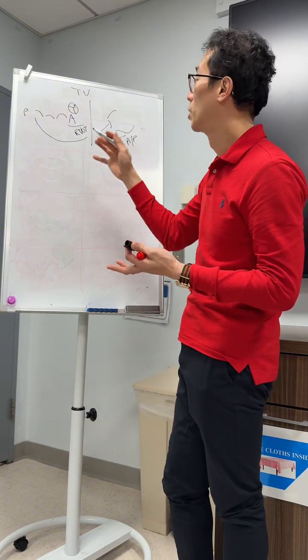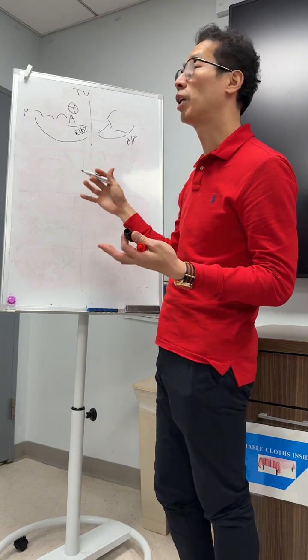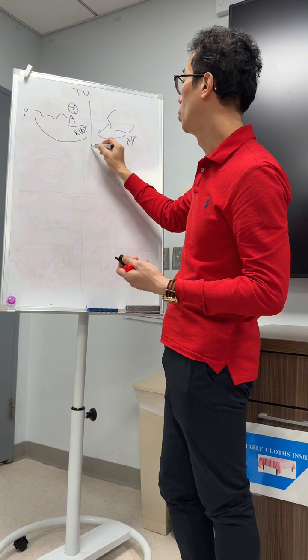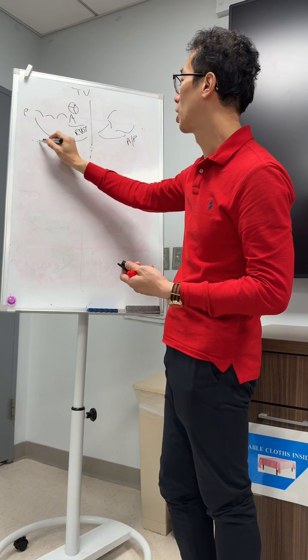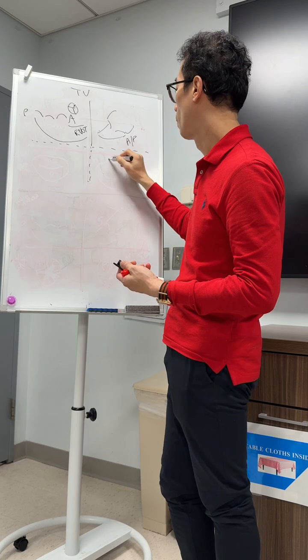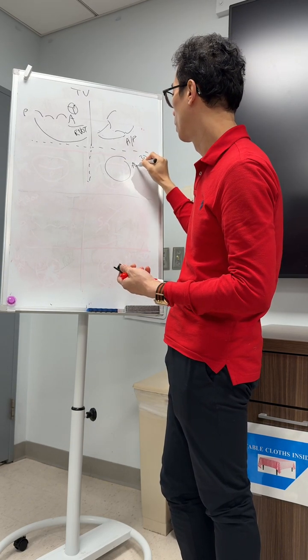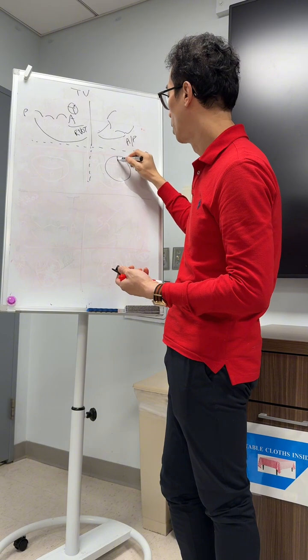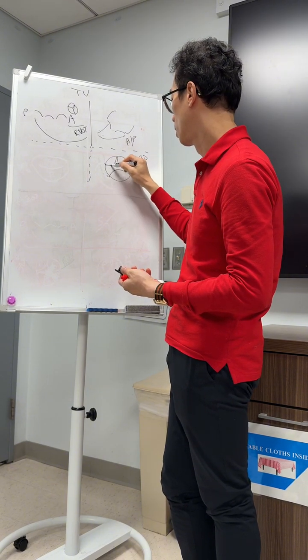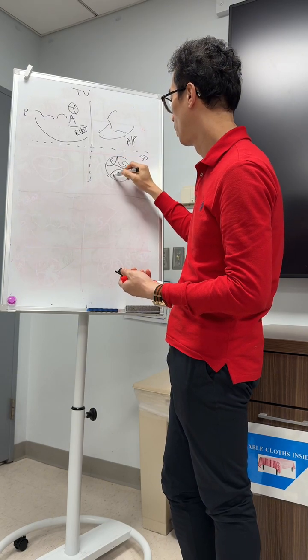In fact, this is the same as if you use ICE, intracardiac echo. The 3D, this is also your home view. Now, when you do your MPR, you're basically just extending this to now a 3D, right, which is aorta here, and then you have your septal, anterior, and posterior.